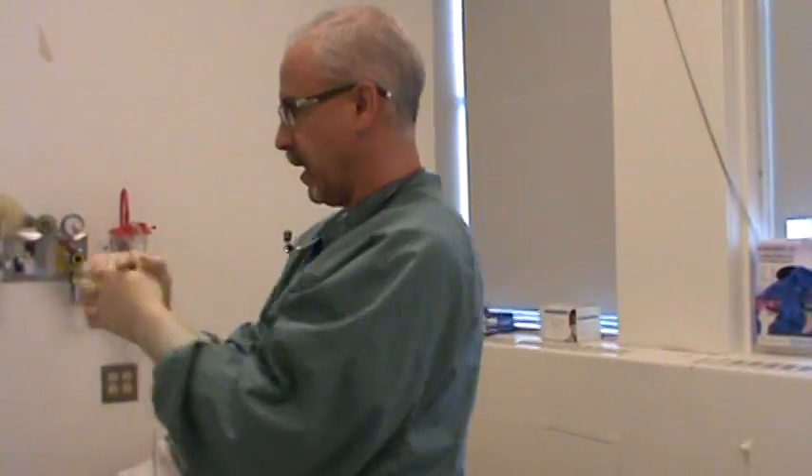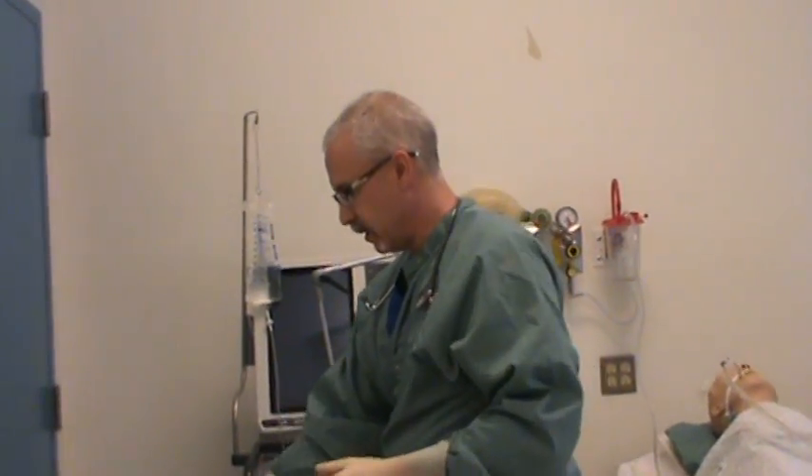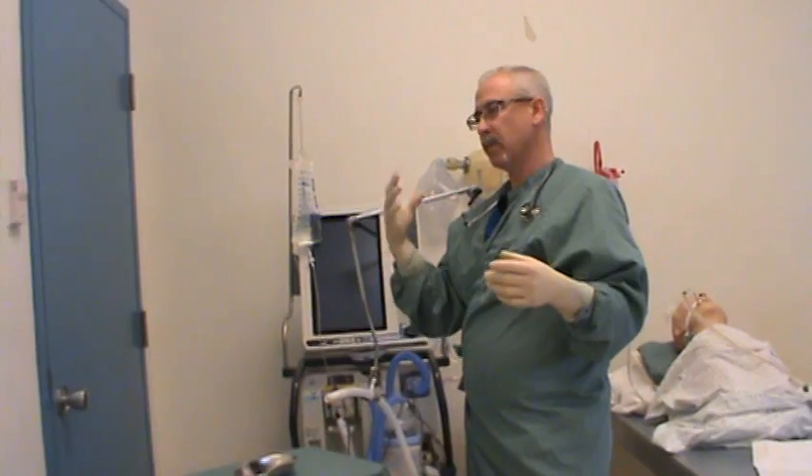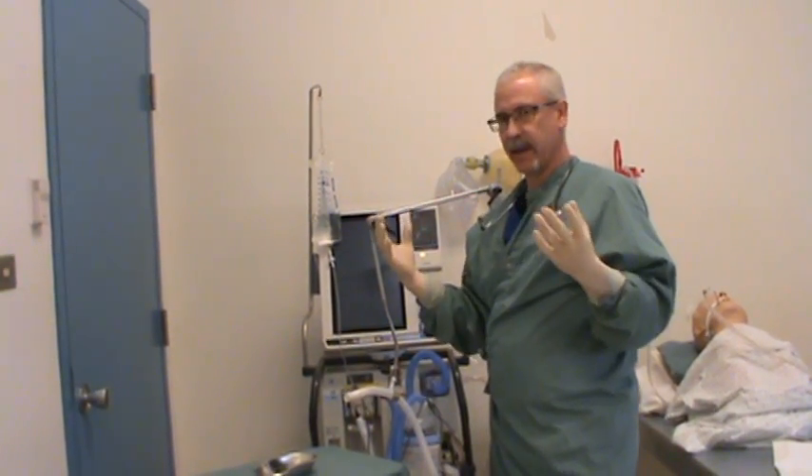Now, to avoid touching anything that could compromise the sterility of your fingers, put your hands together like this, and then walk over to wherever your sterile field is. You can then grab whatever is on your sterile field with both sterile hands until one hand becomes clean while the other one remains sterile. I'm right-hand dominant, so I like to have my right hand as my sterile hand and my left hand eventually becomes my clean hand. If you're doing a sterile procedure where both hands need to remain sterile, keep them both sterile by paying attention to what you're doing and ensuring you're not touching anything contaminated that would wreck the sterility of your gloves. And that's how you put on sterile gloves.